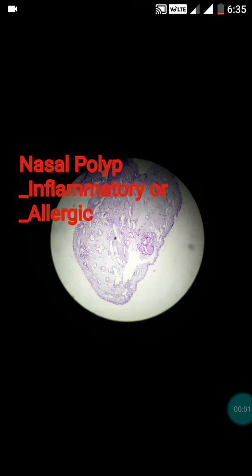Hi friends, today we will discuss regarding the nasal polyp. What is the nasal polyp? The nasal polyp is a proliferative growth in the nasal passage. Actually it is not a tumor — it is among the inflammatory proliferative processes.